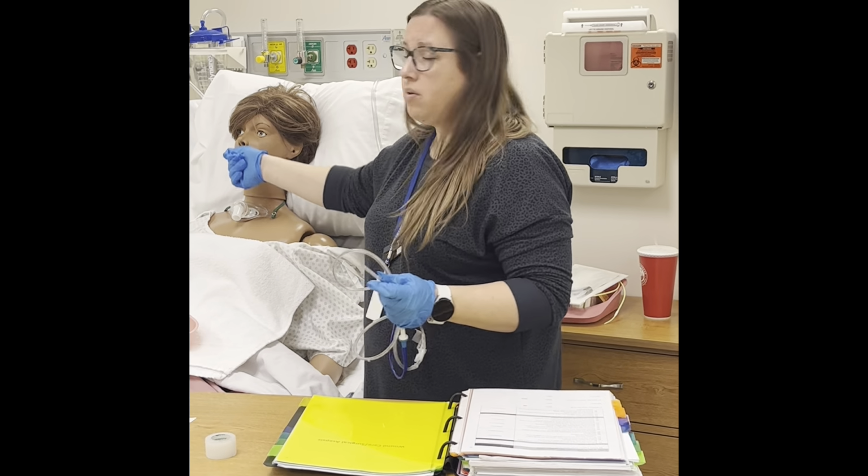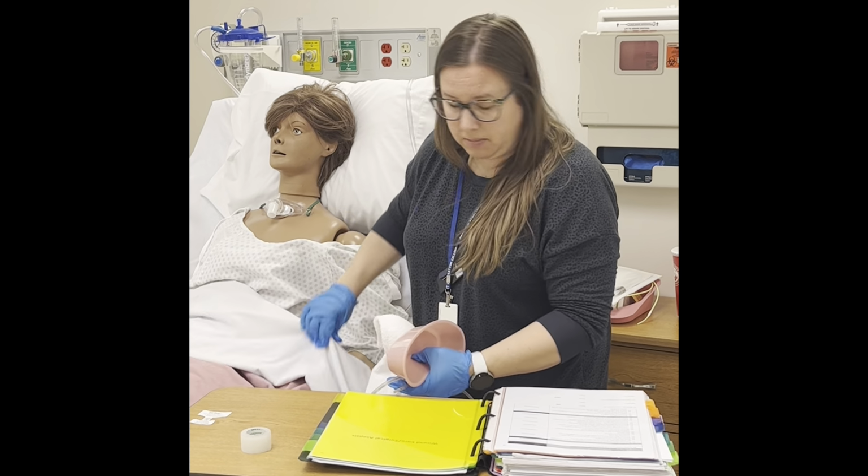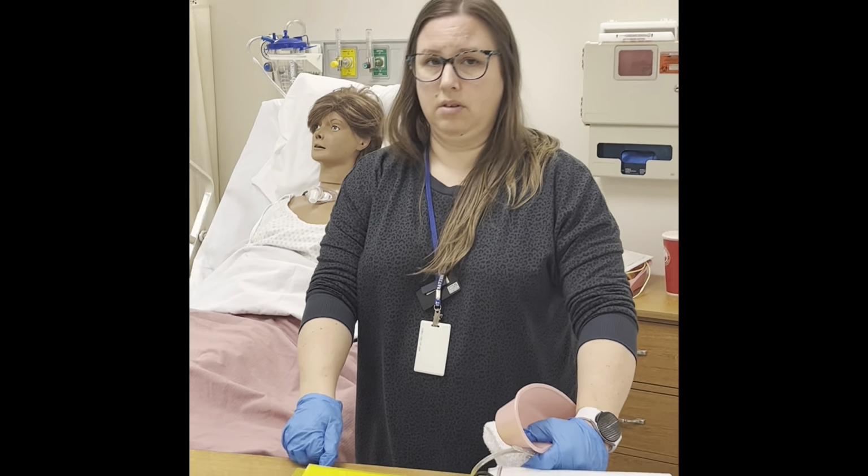Again, we're gonna provide them some oral care, get rid of everything, put them in a comfortable position, give them their call light, remove our gloves, and leave.